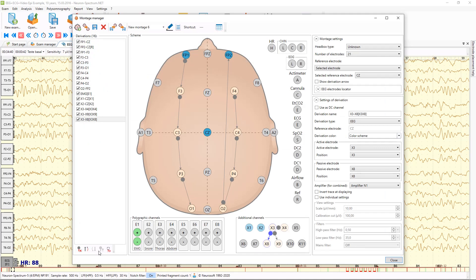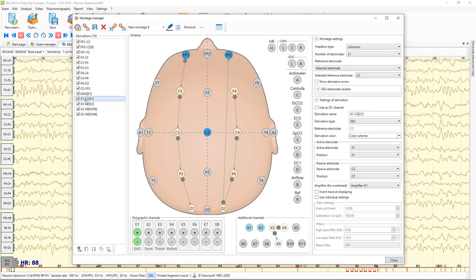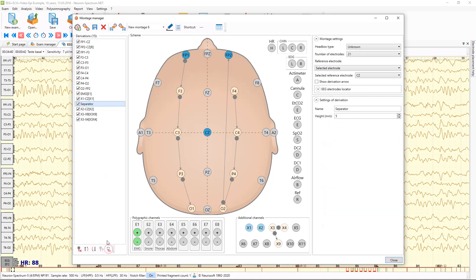Using these buttons you can remove derivations and sort them. Or you can add separators. In the separator settings you can set the height of the separator in millimeters.